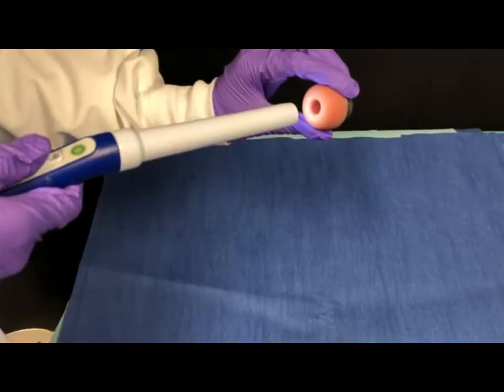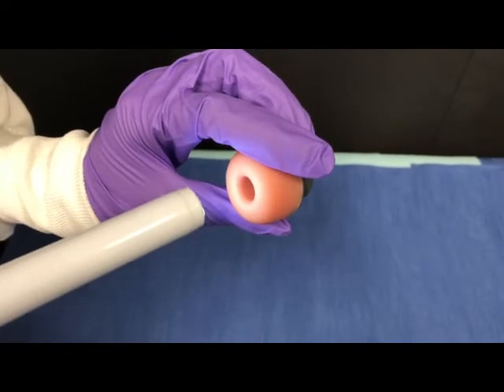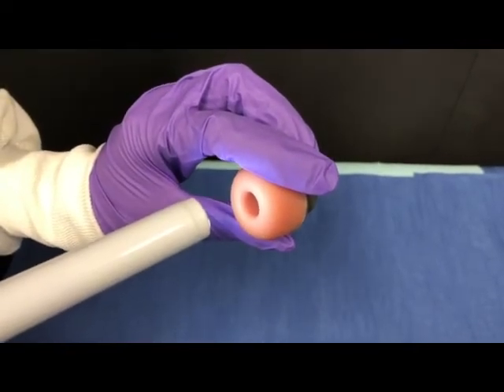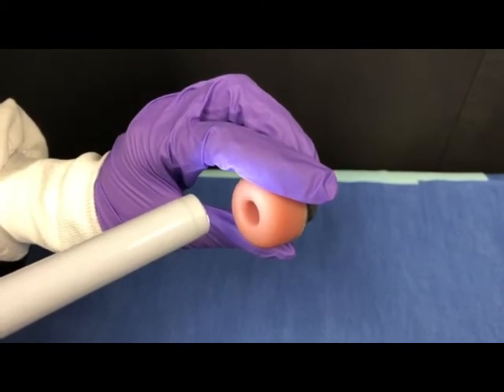Use a model cervix as a target to practice focusing the image gathered by the pocket colposcope. If you are still unable to collect a focused image and it appears as though the pocket colposcope is malfunctioning, contact Hadley Health Technologies.